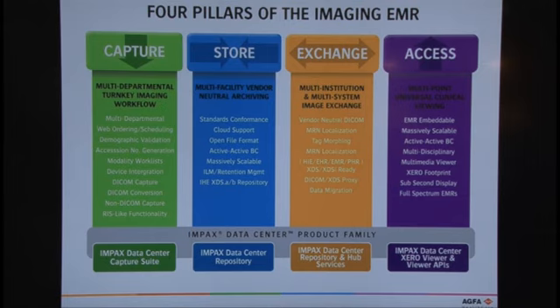The medical imaging repository must be able to enable the enterprise to provide capturing of medical imaging data that has high quality demographics, high quality study identification, and also has the ability to provide services to the department that the systems in that department can integrate to.